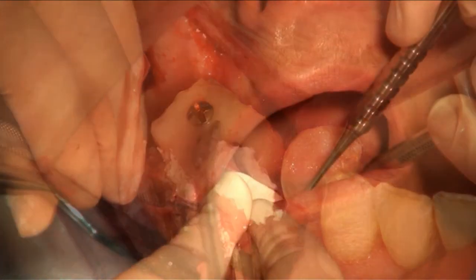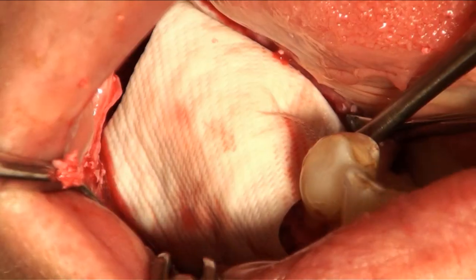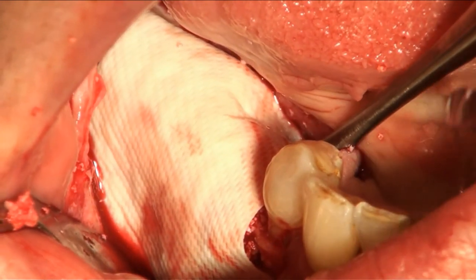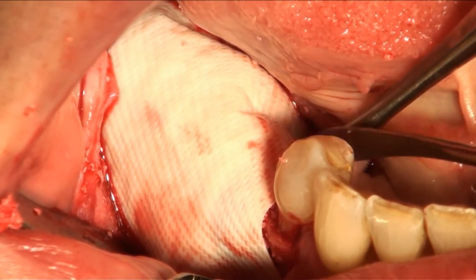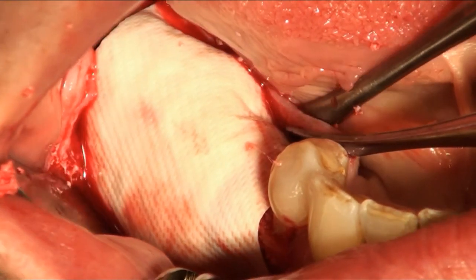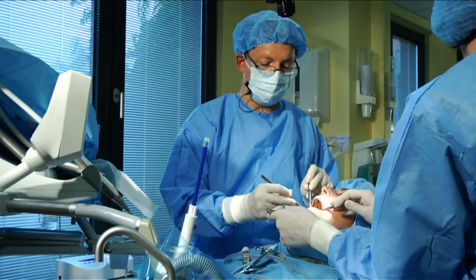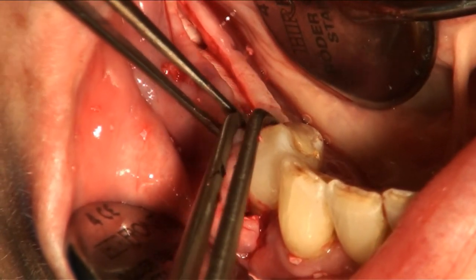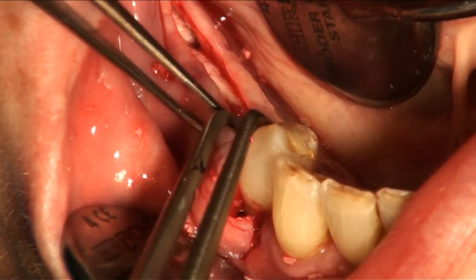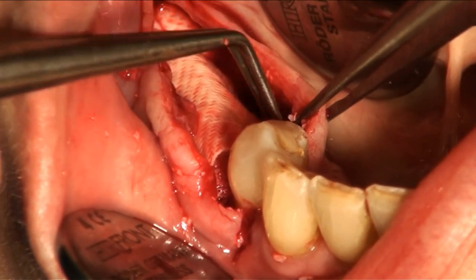So here we go. Now we apply the cross-linked collagen material. That's how it looks after the membrane is in place. It doesn't need any additional fixation. It will be fixed by the flap. So now we see soft tissue closure is completely achieved without any tension to the soft tissues. So I have to take care of the membrane here.